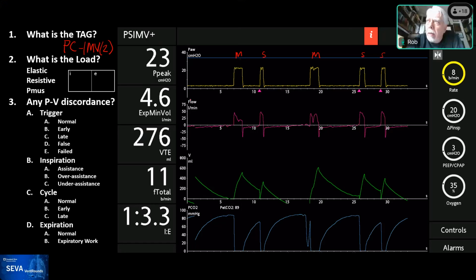Well, in type 2, spontaneous breaths suppress mandatory breaths if the rate of spontaneous breaths is higher than the set rate. But for IMV type 3, it's not based on the spontaneous rate, but on the total minute ventilation. So you have a minimum minute ventilation set by the tidal volume and the set rate.